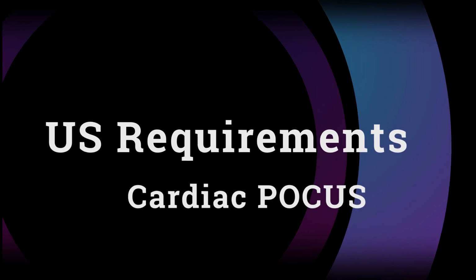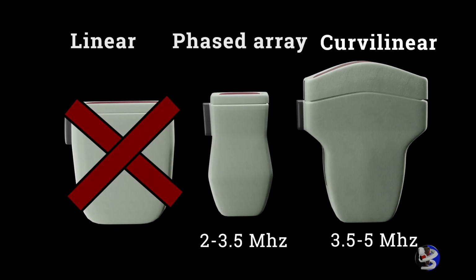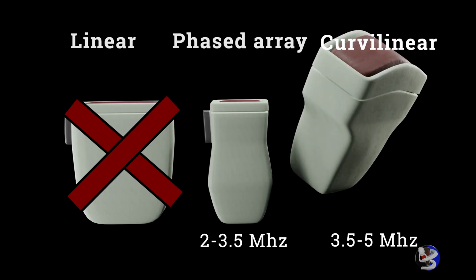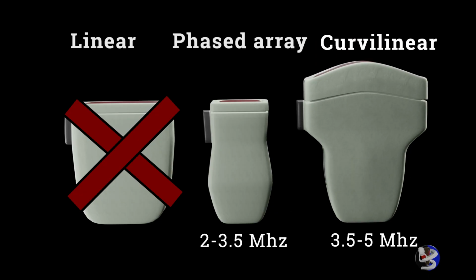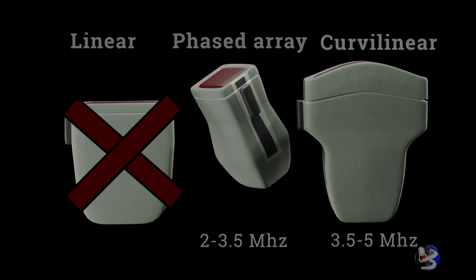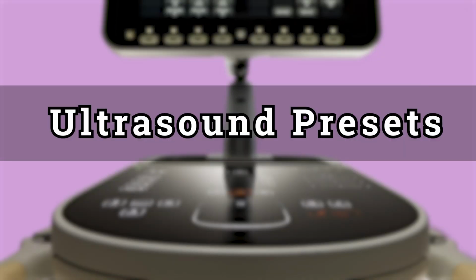Technology. The POCUS exam uses 2D or M mode primarily. Color flow Doppler will be referenced here as it's part of the OSCE's requirements. However, guidelines do not recommend its use for the POCUS exam. We'll be using a phased array probe almost exclusively. Alternatively, we could use the curved linear probe, but its use is limited because of its large footprint. Regardless of the probe used, note the position of its indicator since it will be important to orient the probe in the patient's chest.